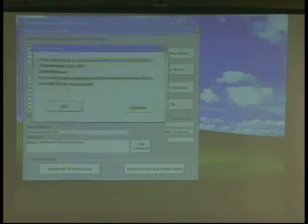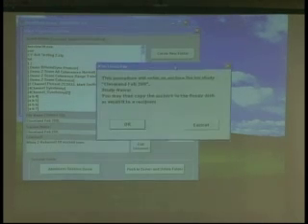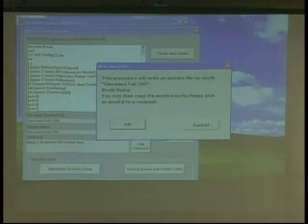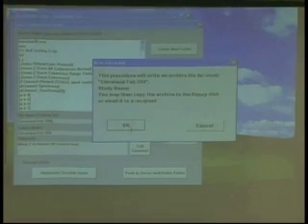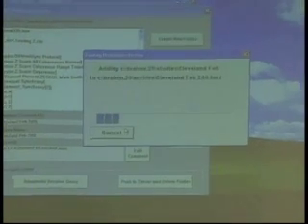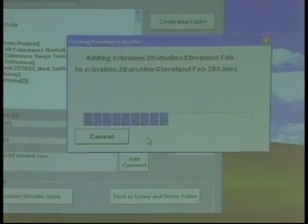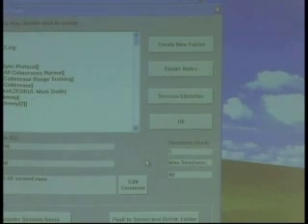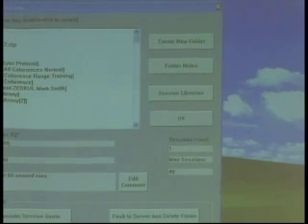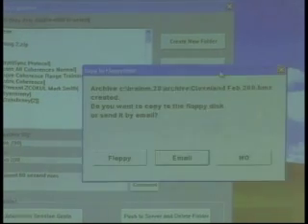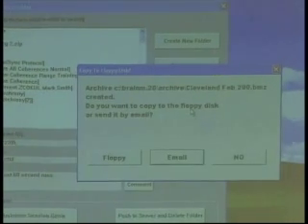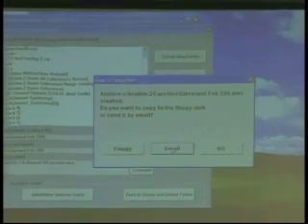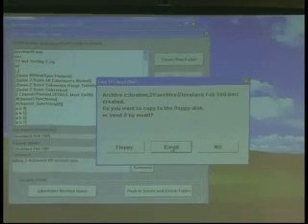And now I get this notice. This procedure will write an archive file for study. Cleveland, February, study name, etc. And I hit OK. And now the BrainMaster software is creating a zip file, which is encrypted and compressed. And I can copy it to a disk or I can say Email.